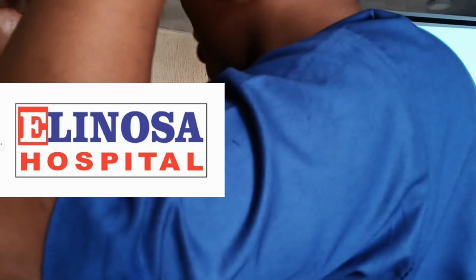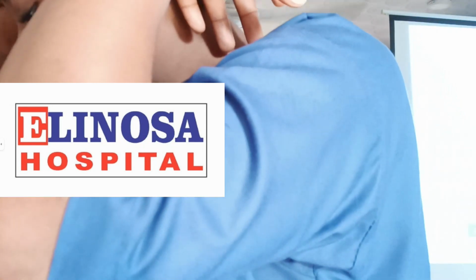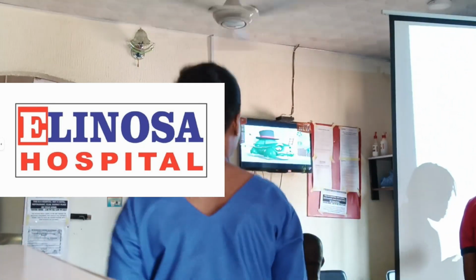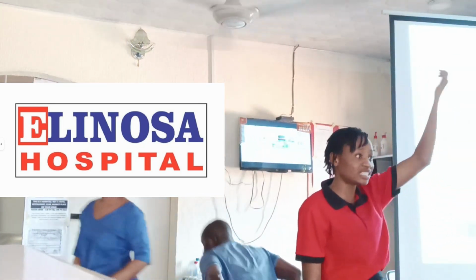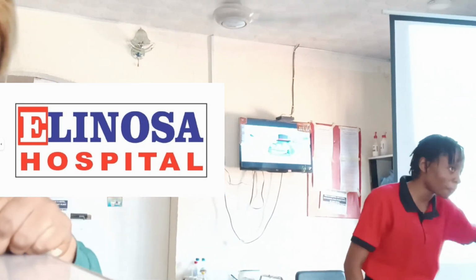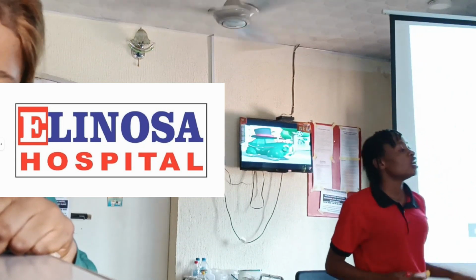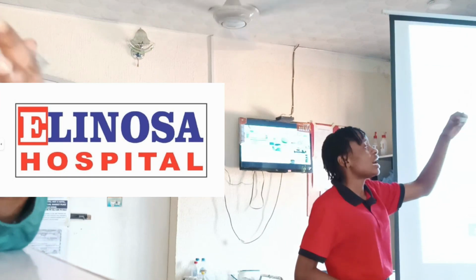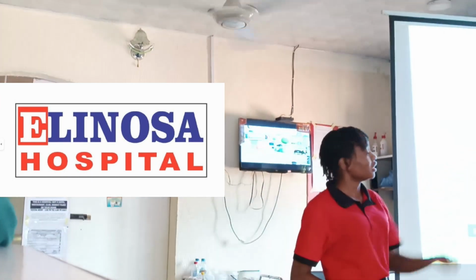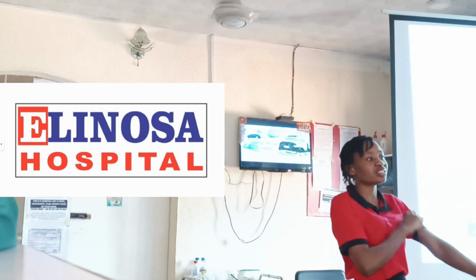Let me explain this. For example, you collect a blood sample, because we have lots and lots of sample containers. This is your EDTA container. The reason they call it an EDTA container is because it contains EDTA, which means ethylenediaminetetraacetic acid. This EDTA prevents blood from clotting. It contains an anticoagulant. An anticoagulant is a chemical substance that prevents blood from clotting by removing or chelating calcium, because your blood contains calcium.